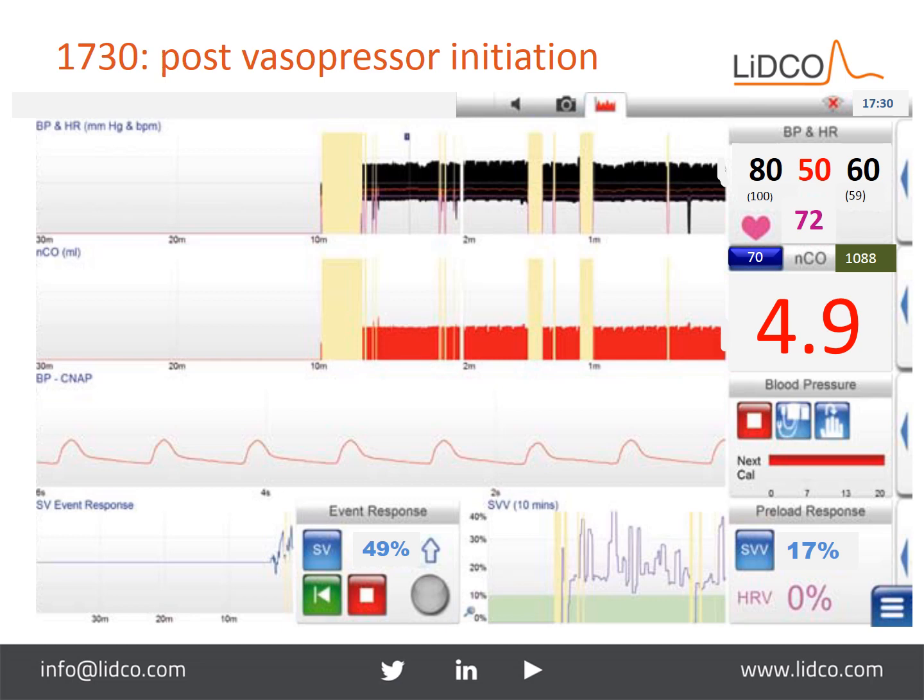So once again, we have to ask the question, does our patient still need fluid? Does he need more pressor? And will he respond if we give that? Well, according to his stroke volume variation, he will be responsive. But the first question we need to ask is, just looking at these numbers, do you still want to do something? So, what do you think?